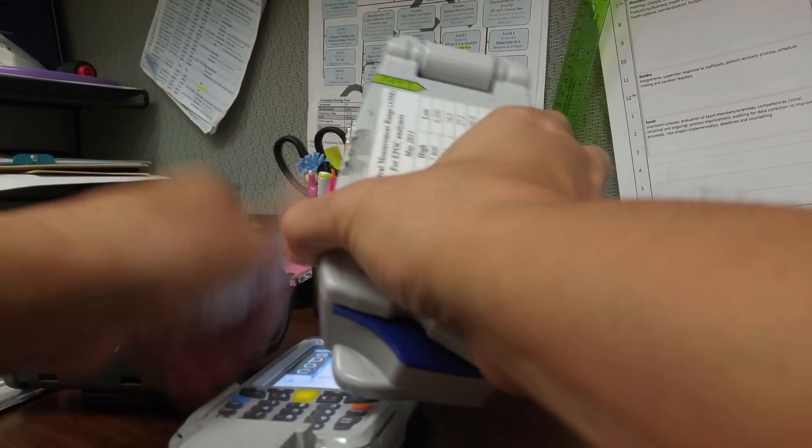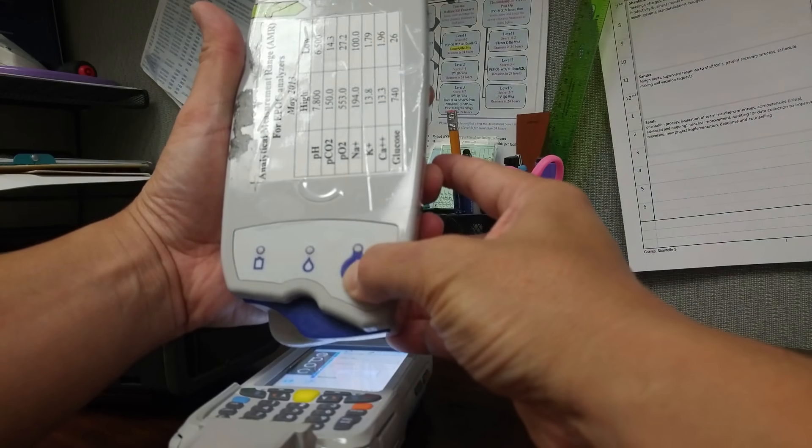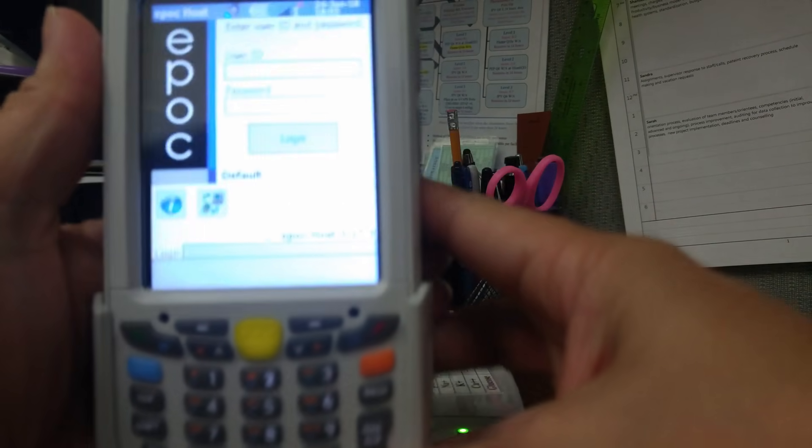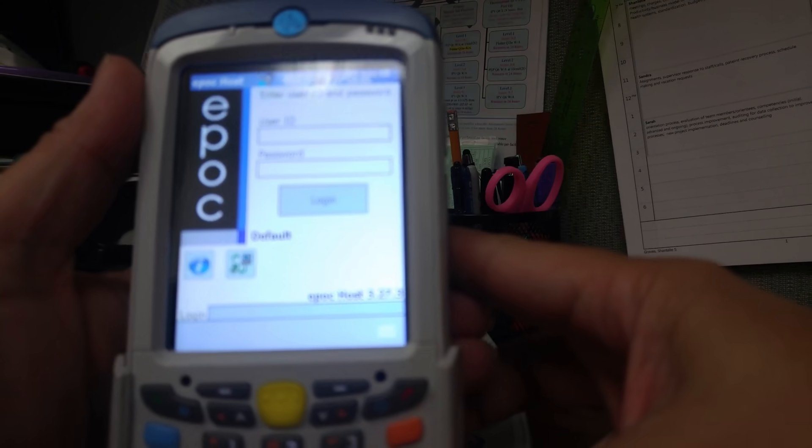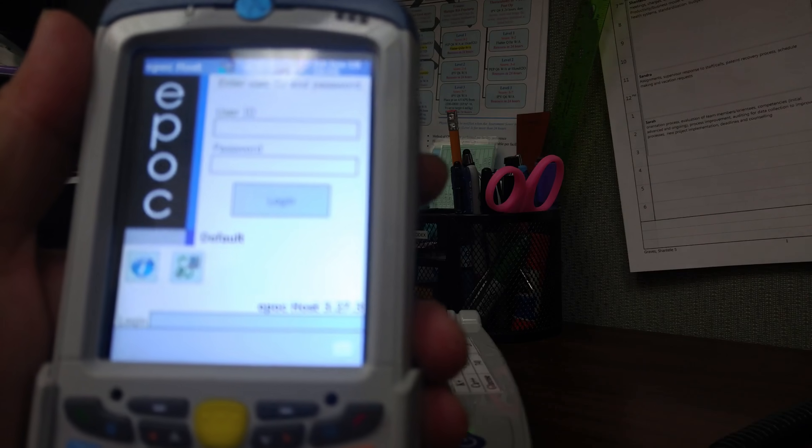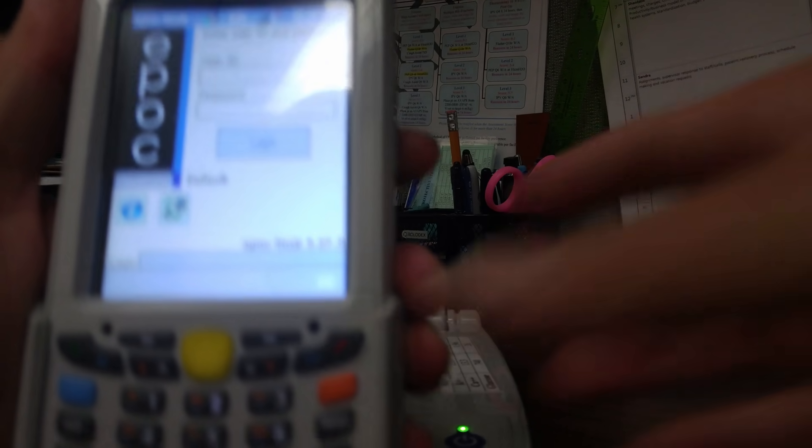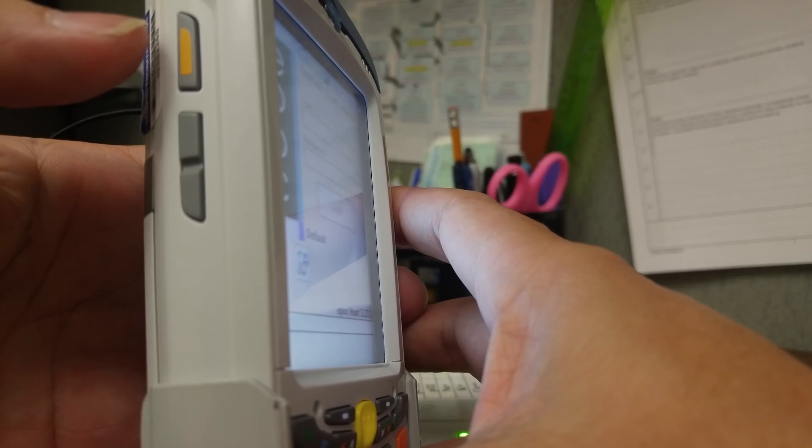The base has an on button. So in order to log in, you have to scan your badge. You can either press this yellow button right here on the side. There's another yellow button on the side right here.